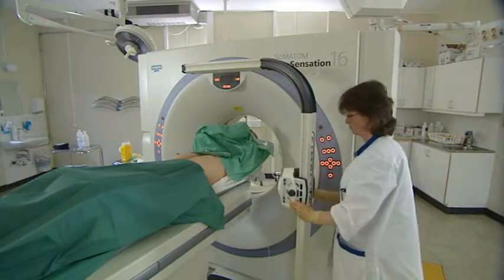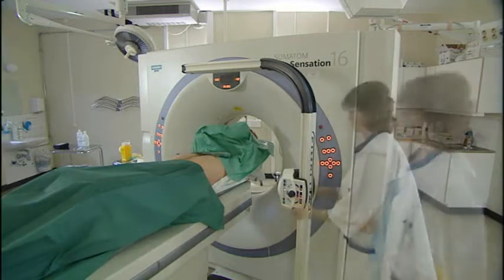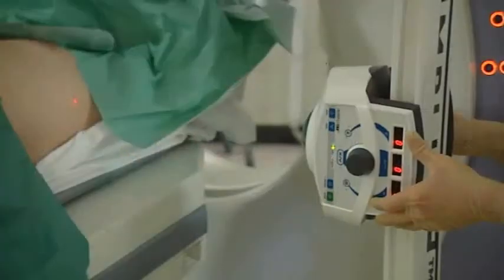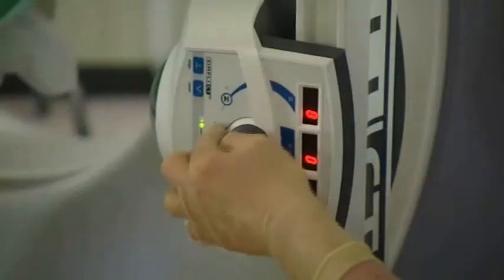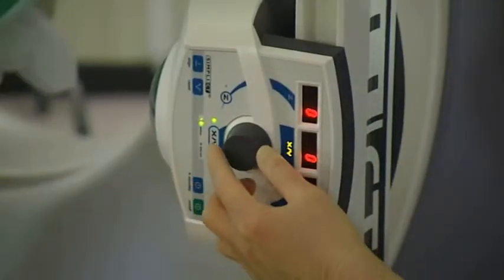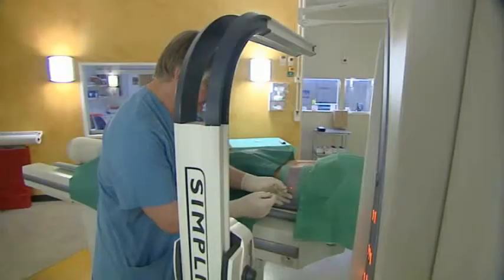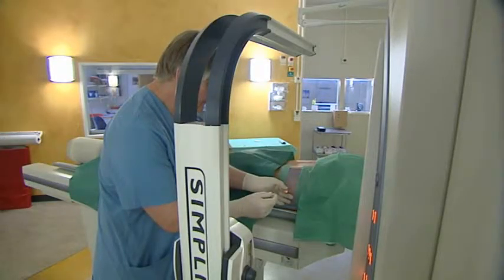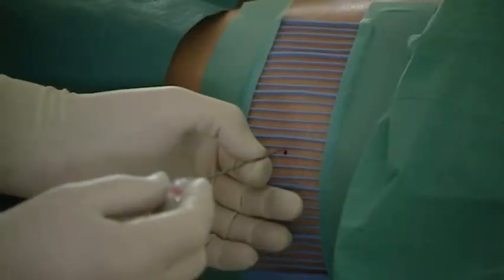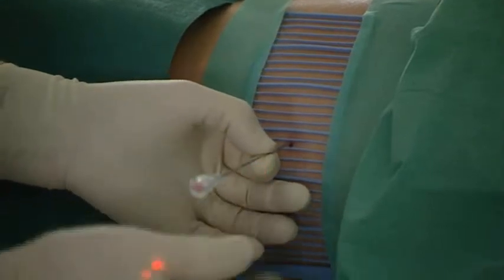Sliding the Simplicity down to the vertical rail, it can be used for any lateral procedure, allowing the patient to be in the most comfortable and stable position. Notice how the needle is placed in line with the laser light when the dot is illuminating the needle hub.